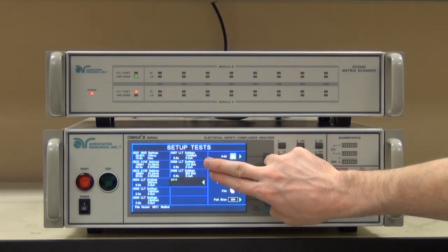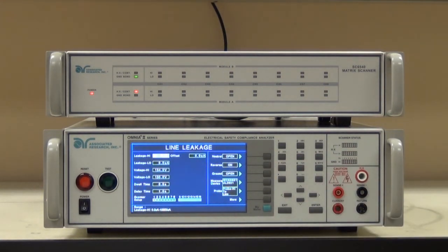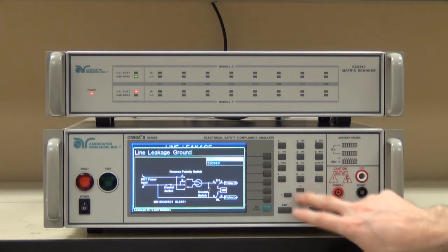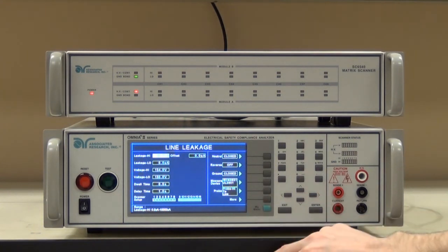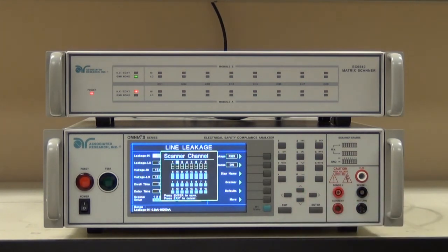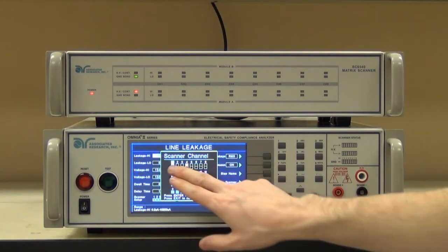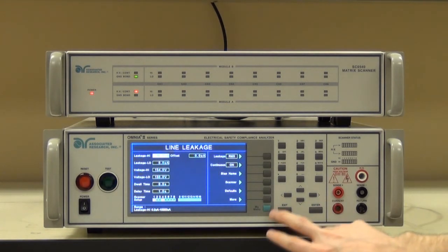We just set a couple tests for patient 1 patient leakage. Now let's do a couple for patient lead 2 to give you an idea how you do that — it's pretty much the same thing we did for patient lead 1. We're going to start with normal conditions, so my leakage high limit goes back to 100 microamps, and I need to make sure that I have my normal conditions set. I have probe high to line, the proper measuring device, normal conditions. Now all I need to do is set the scanner. This time we're going to be dealing with patient lead 2, which is connected to channel 4. So I'll set channel 4 high, and probe high is still on channel 1, so channel 1 high. All I did was shift where I'm connecting probe high — which is what you'd do manually with clip leads.